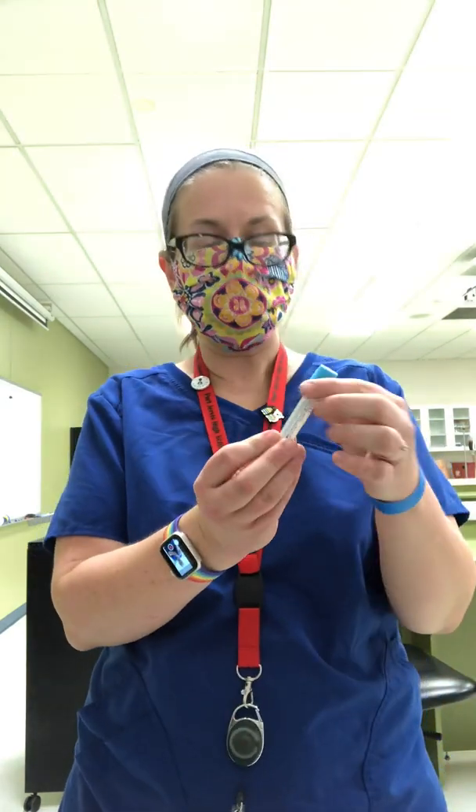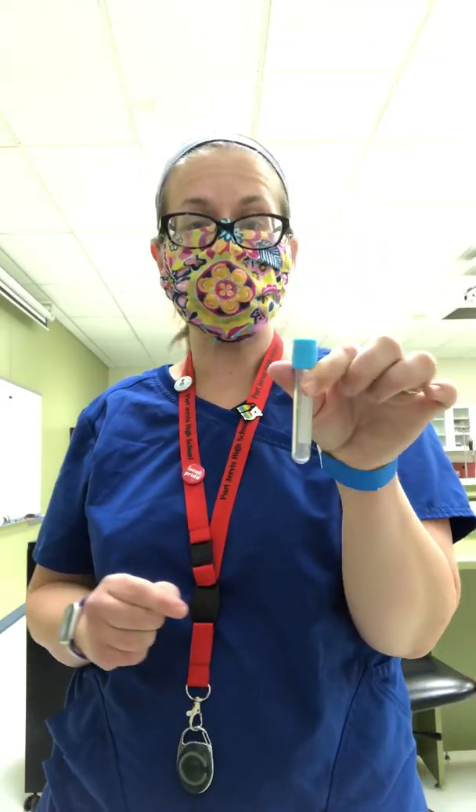Next is light blue. Inside the light blue tube is sodium citrate. This is for coagulation studies — PT, PTT, and INR all go in light blue.